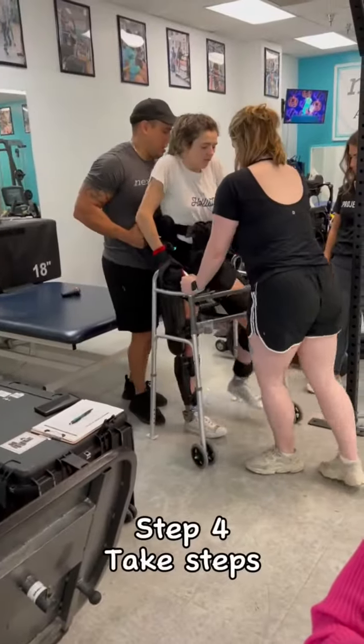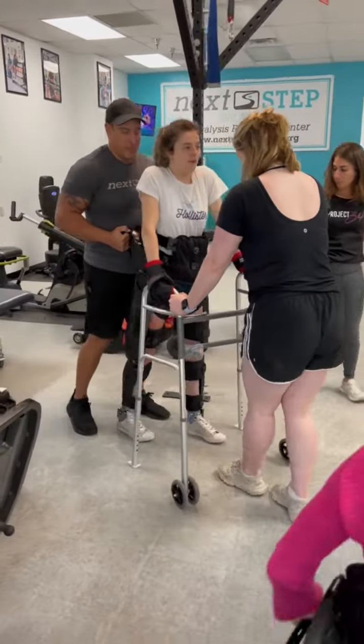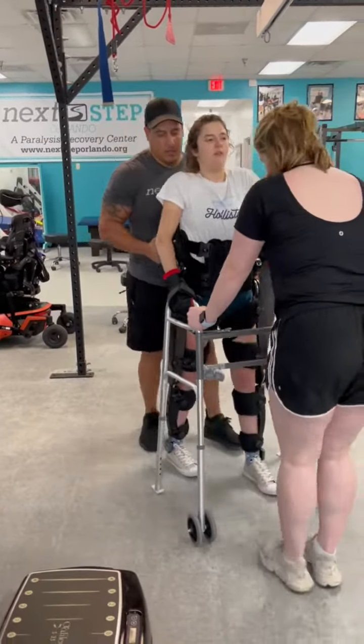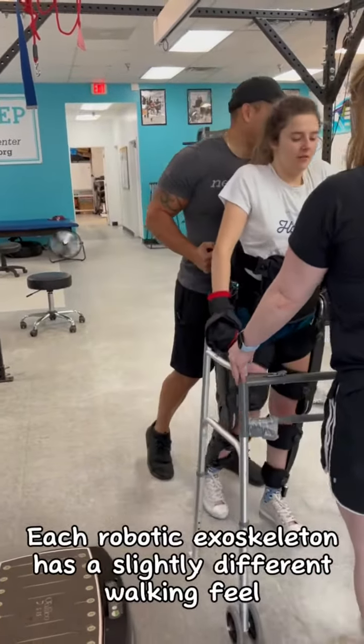Step 4: take steps. The first walk is a bit clumpy.